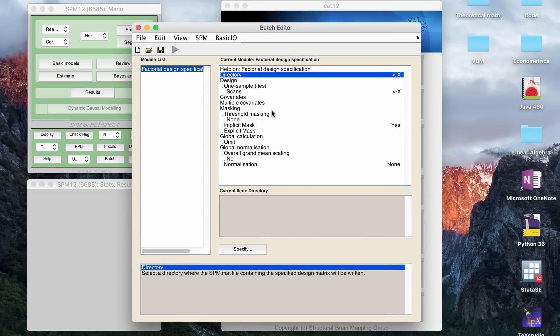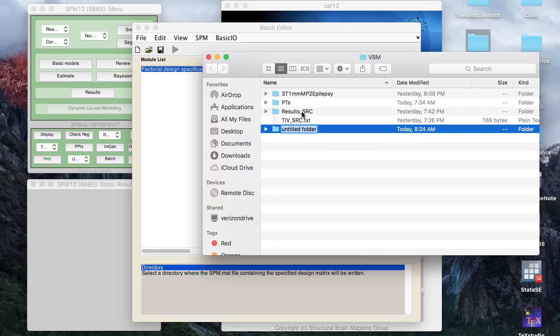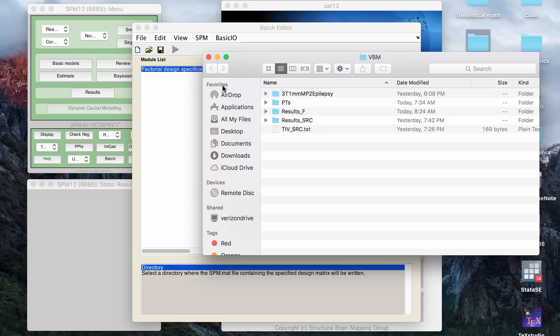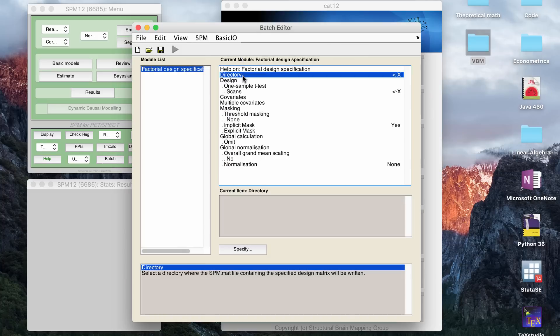So for this, the first thing it's going to ask you is for a directory. So what I do is in my VBM folder, I'd create a results folder, as you can see. So you can say results of an f-test, whatever, and that's what it's asking you for the directory. So you put in the folder location where you want it to output all the results. That's here.